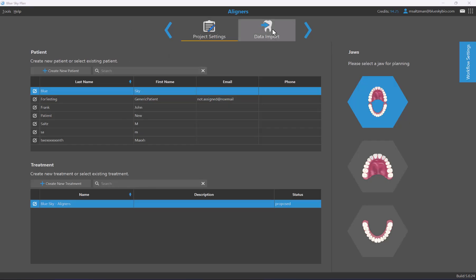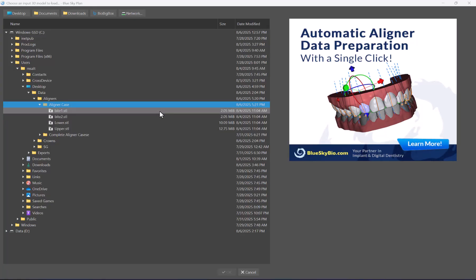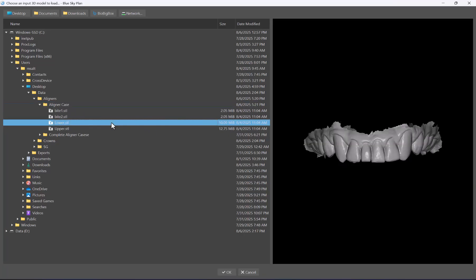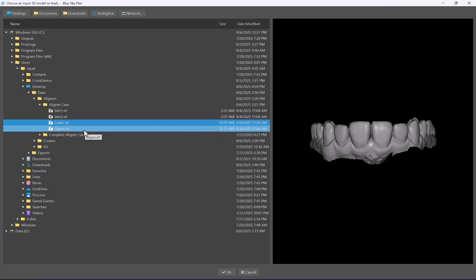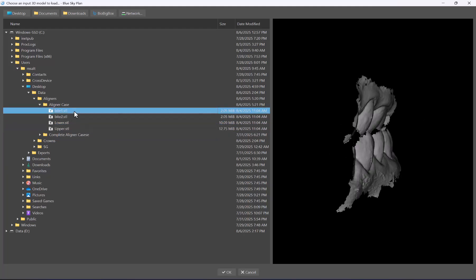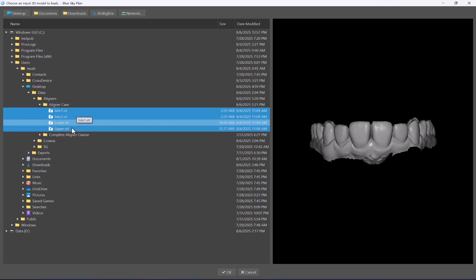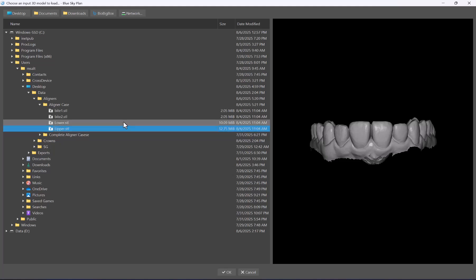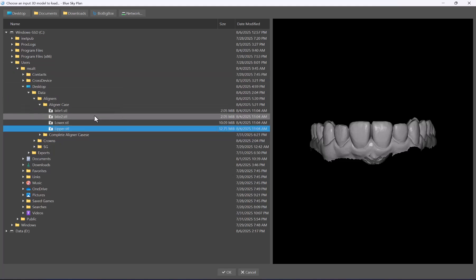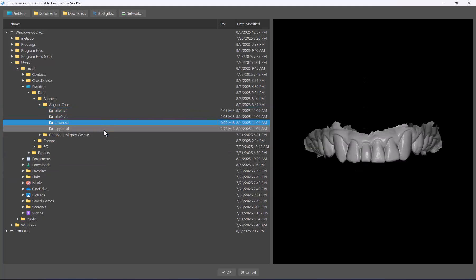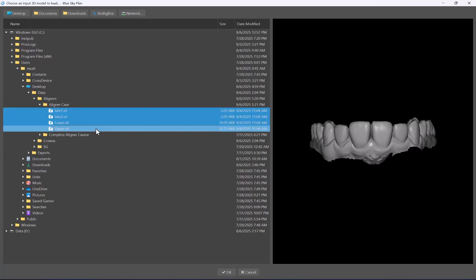Once you've completed the second screen, click data import or the next button. The software opens a dialog box to prompt you to select and load the relevant files for your case. We have our two jaws — you can multi-select by clicking the first file and holding shift to click the last, or hold control to click individual files.